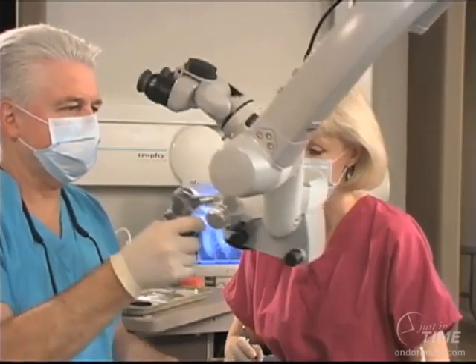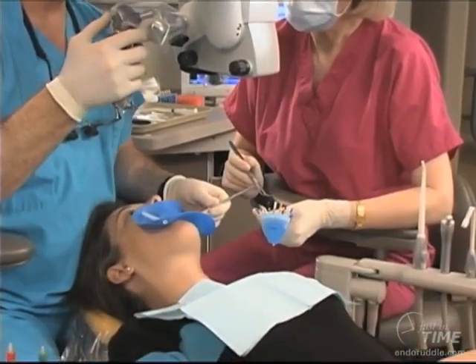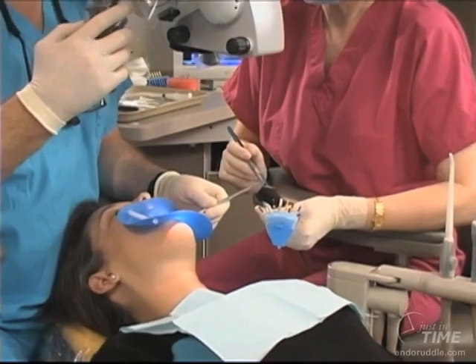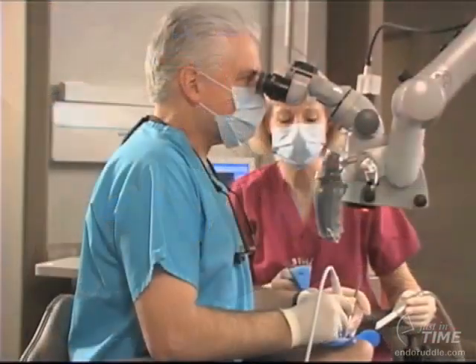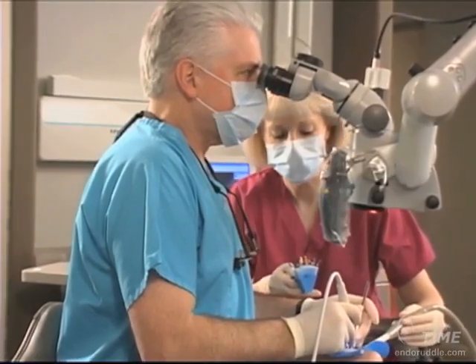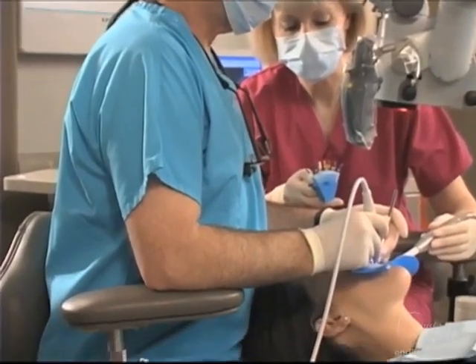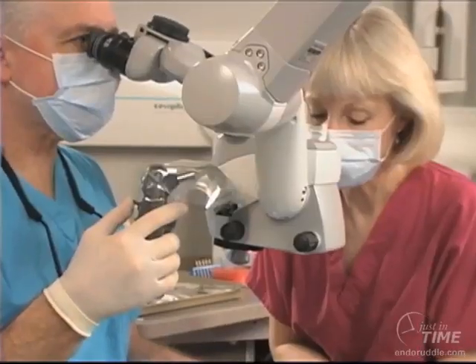Well, there's a few tools that we would all agree would be very useful to have if we were going to do access preparation. Certainly the dental operating microscope is a very invaluable tool to help us see big and bright. But beyond big and bright, we can see color and texture as well. Certainly it emphasizes chair position, lumbar support. We can support our arms.